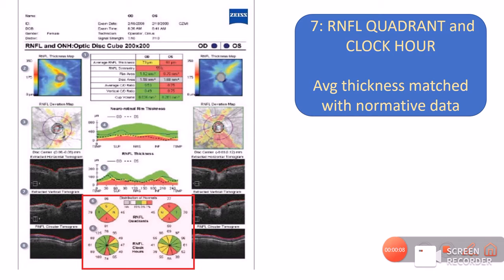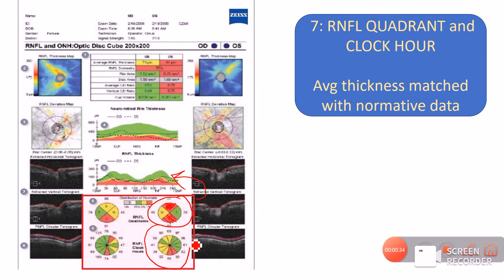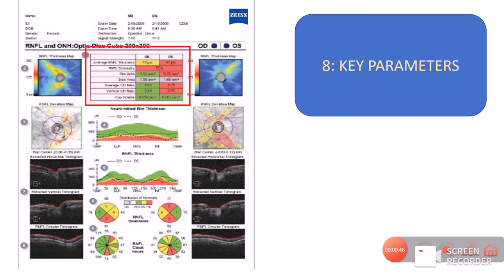The next component is the RNFL quadrant or clock hour maps. The circle is divided into four quadrants — superior, inferior, temporal, and nasal. Color coding is similar to the TSNIT map: red indicates danger (very thinned RNFL), yellow is borderline, and green is normal. We also have a clock hour representation in which the circle is divided into 12 clock hours, and the RNFL thickness is represented for each clock hour.